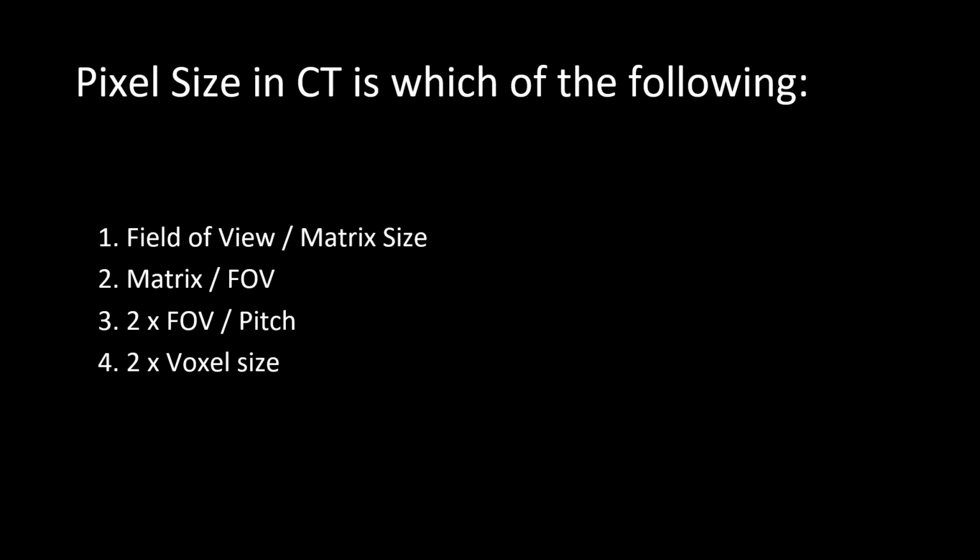Okay, pixel size in CT is which of the following? Field of view over matrix size, matrix over field of view, 2 times the field of view over pitch, or 2 times voxel size? The answer is field of view over matrix size.